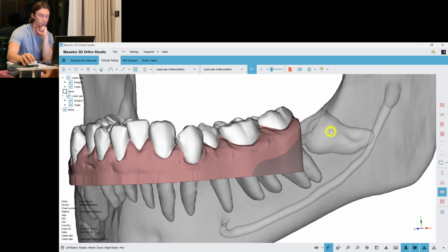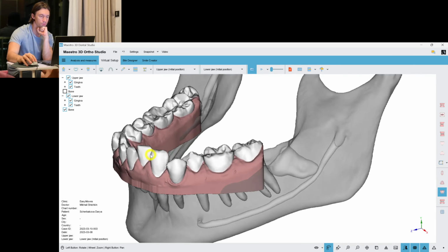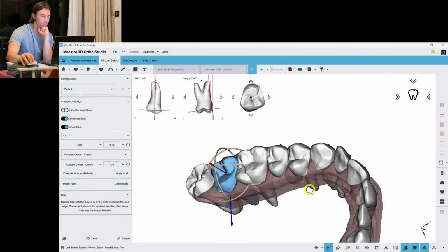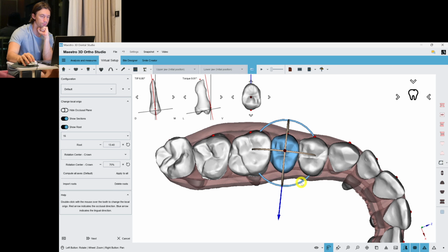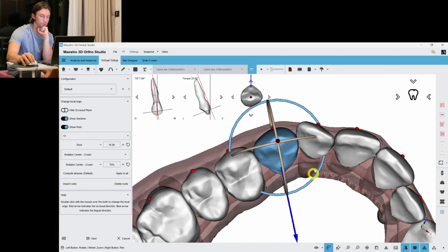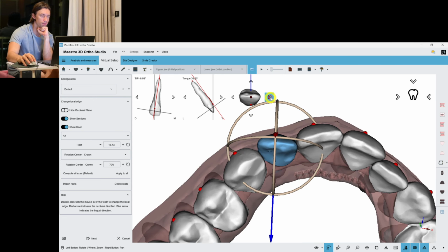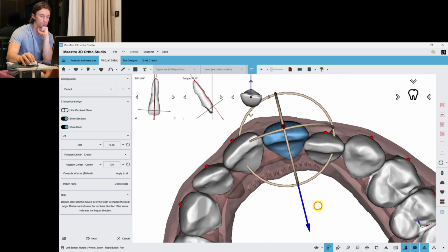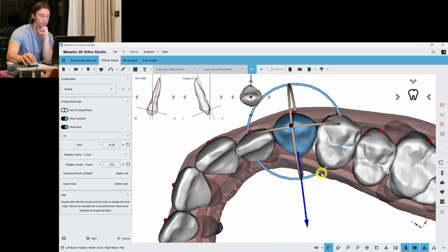They will have to extract this third molar before we start the treatment. Now we do same on the upper jaw. I'm not a big fan of improving these small rotations of the premolars, so I just expand and leave these small imperfections as they are, because it's more stable and it doesn't affect the aesthetics.